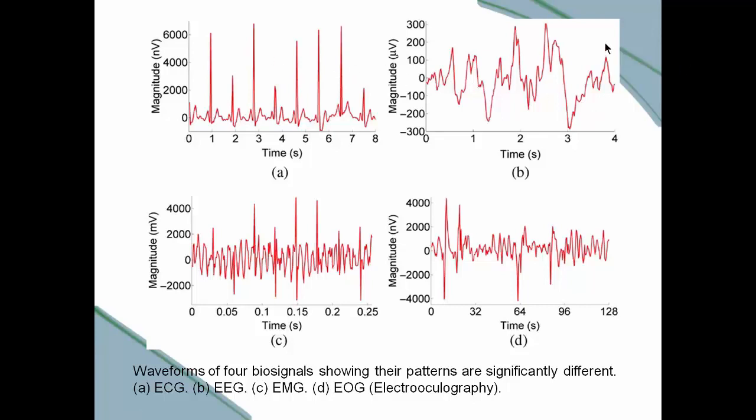And we will talk about how we extract, through technology and through a process of on-the-fly statistical computing called fast Fourier transform analysis, the wave characteristics even of the EEG. Very, very important technology in doing that.